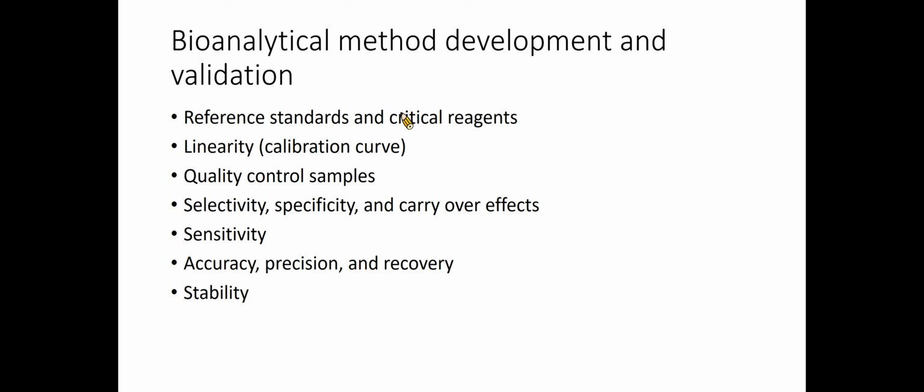The purpose of bioanalytical method development is to define the design, operating conditions, limitations, and suitability of the methods for its intended purpose, and to ensure that the method is optimized for validation. Before the development of a bioanalytical method, you should understand the analyte of interest, such as determine the physical chemical properties of the drug, in vitro and in vivo metabolism, and protein binding, and consider aspects of any prior analytical methods that may be applicable.